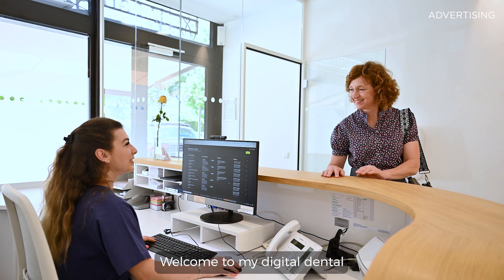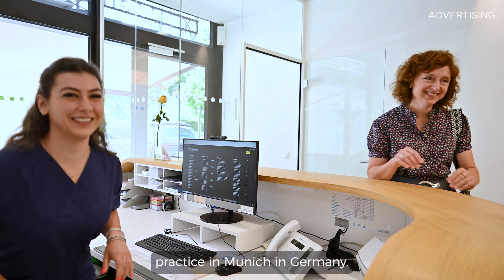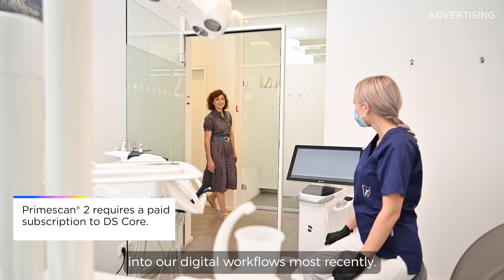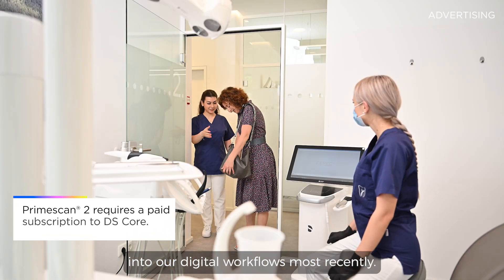Welcome to my digital dental practice in Munich, Germany. I am Dr. Gertrude Fabel, and we implemented PrimeScan2 into our digital workflows most recently.